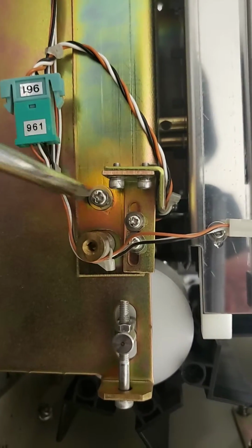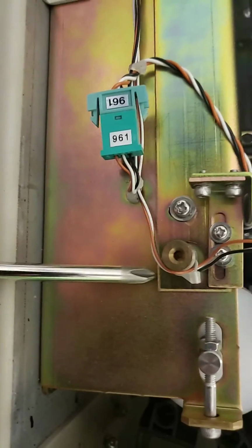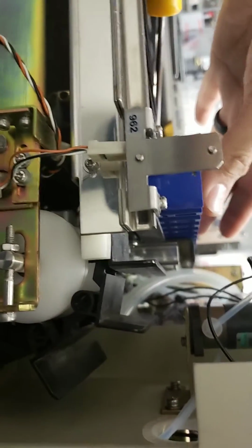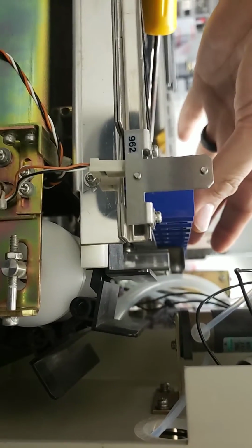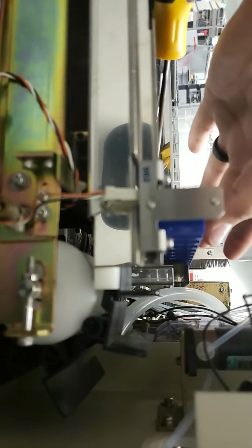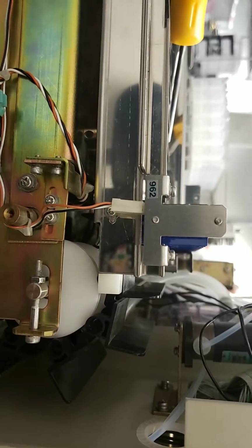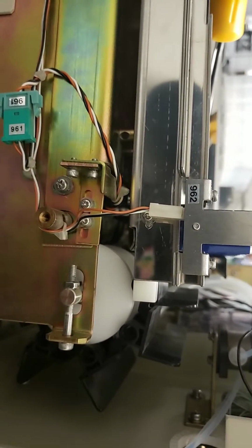So for our purposes, it's going to be this screw right here, and when you undo that, like I said, you want to just barely tap up, maybe just tap down, and you'll see that rack kind of lean forward, lean backward. But like I said, we're looking for a little bit of a transition where it goes down, but not enough to where the belt will spin underneath it. So you kind of have to find a fine line. It's basically like, oh man, half a millimeter, maybe half a centimeter or something like that. It's much less than that, but something to that transition. So that's pretty much how we do it.